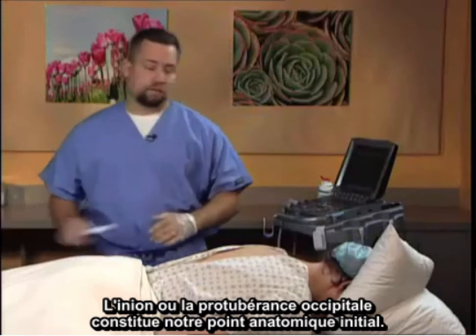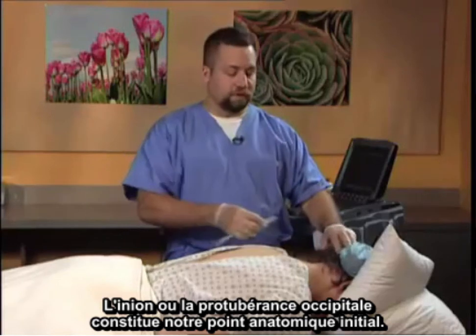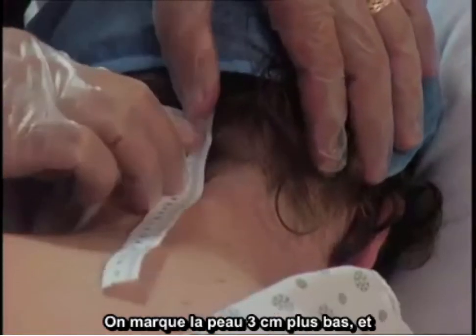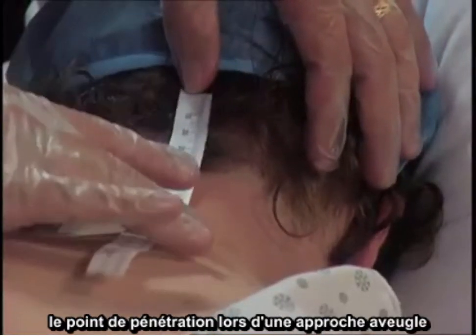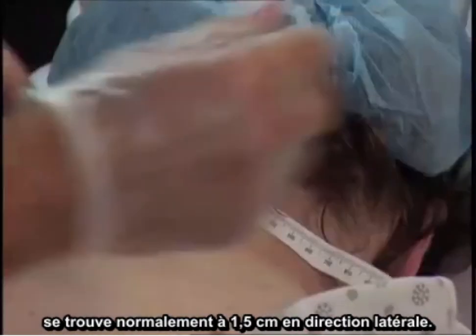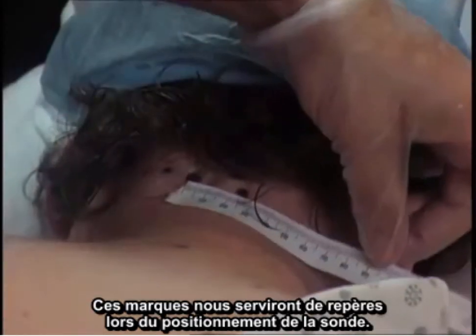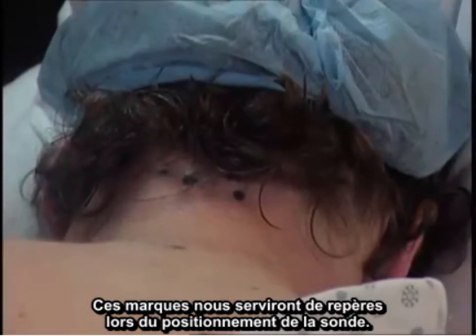The anatomic location to begin is the inion or the occipital protuberance. Three centimeters below this, the skin is marked and then typically one and a half centimeters lateral to that is the entry point for the blind technique. These will serve as our landmarks to place the ultrasound.